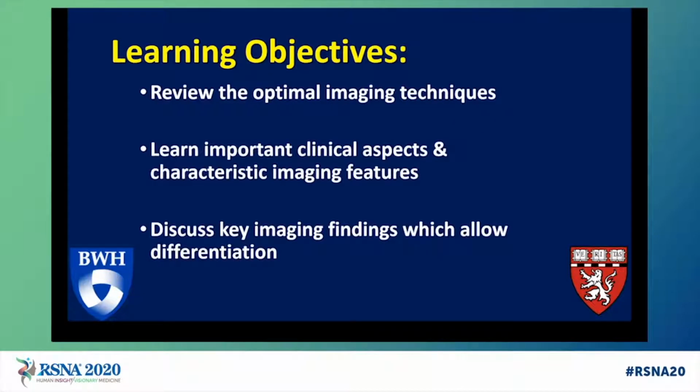Our learning objectives are to review some optimal imaging techniques and to learn some important clinical aspects and characteristic imaging features of subcutaneous soft tissue masses, in particular to discuss key imaging findings which allow differentiation between each of the differential diagnostic subtypes.